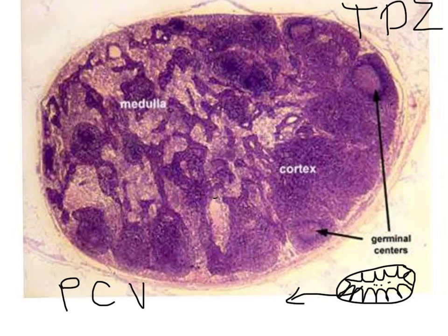Also here you may have the label for this dark irregular area. These are the medullary cores. What about the medullary cores? The medullary cores are formed of B lymphocytes and plasmablast and plasma cell.